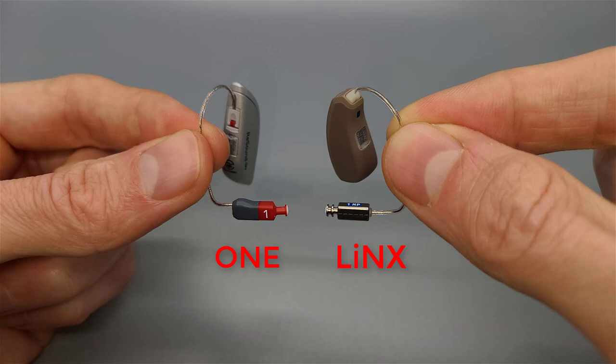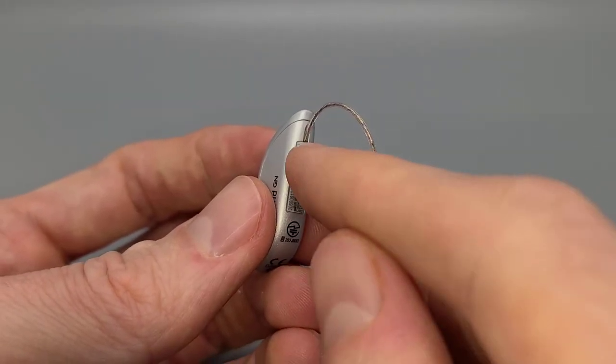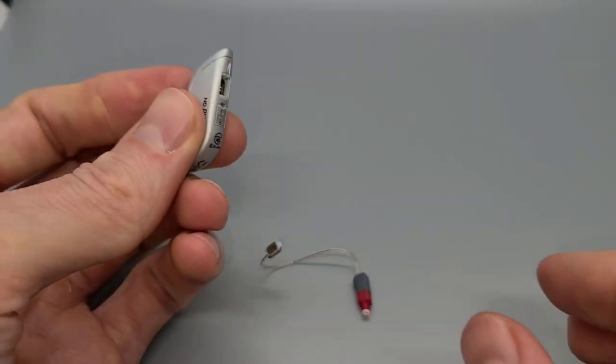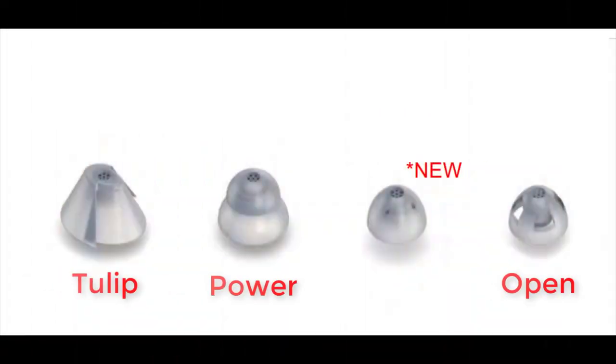The new receivers hold onto domes much better than the old ones did, and should help to better prevent domes falling off inside of ear canals. ReSound does have new retention filaments to help keep the receivers inside of your ears, which I like much better than the previous versions used on the Lynx. ReSound has also added a new dome style — finally adding what they call a closed dome, which was a much needed addition, because up to this point I've been fitting different manufacturers' closed or vented domes on ReSound receivers for years.